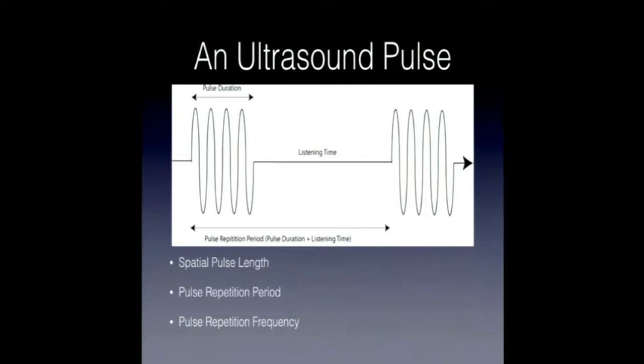And then it sends out another pulse, and it listens. And this is not to scale. The listening time is very, very long, and the pulse duration is very, very short in comparison. And this becomes important because there's the spatial pulse length. So that's the duration right here that I've shown.